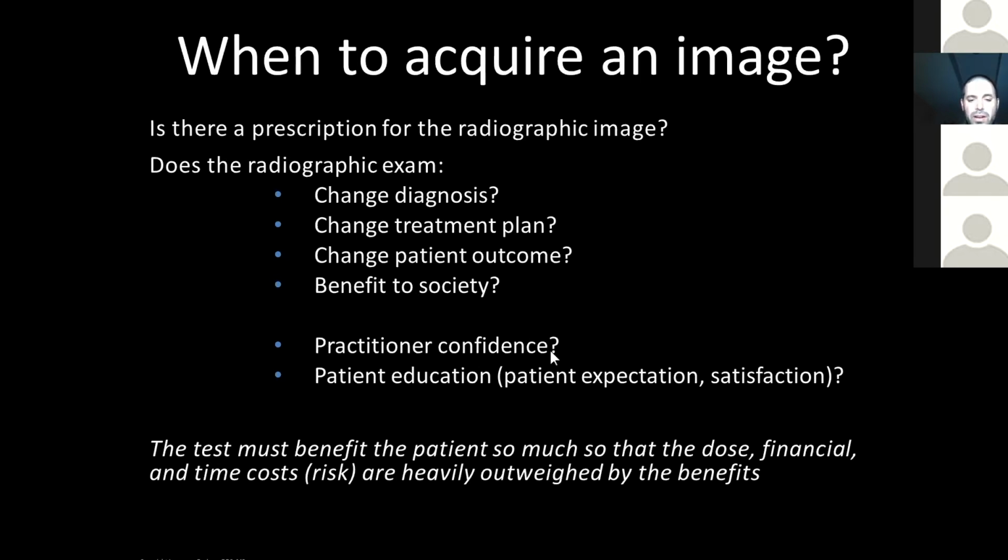Couple other perspectives I want to introduce. I hear a lot from people say, well, I'm just so much more confident if I have that cone beam CT scan. And that's why I order it. And I say, well, careful, because I've met some fairly timid clinicians who are fantastic and some fairly confident ones who are not quite fantastic. So if you're asking yourself this question, you really should be thinking back to, am I confident in my treatment plan decisions, even the nuances and what might influence slightly a small decision in my treatment plan? And then also, is it making my patient outcomes better? Is that adding to my confidence?